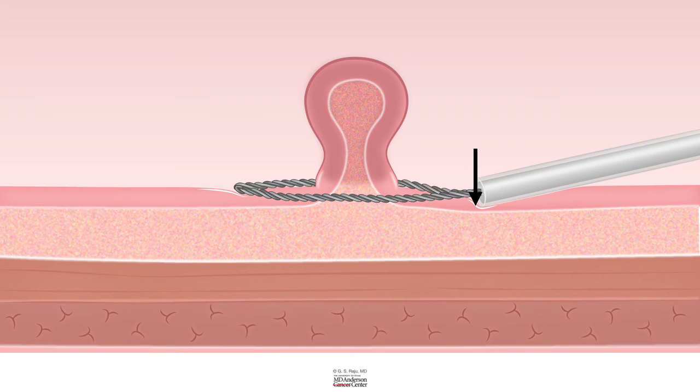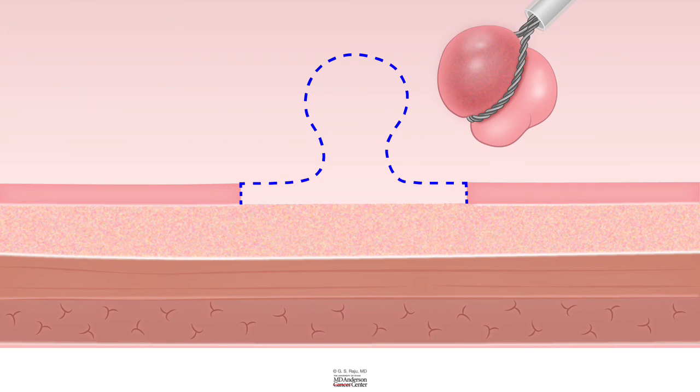When you ask the assistant, the assistant is supposed to close it fast so that the cut is like a guillotine cut. When you remove a polyp with a cold snare, you should see the polyp and the surrounding normal mucosa as if you are seeing the sunny side up of an omelet — polyp in the center and a little bit of normal pink mucosa surrounding it. In that way, you could ensure that you did achieve complete en bloc resection.